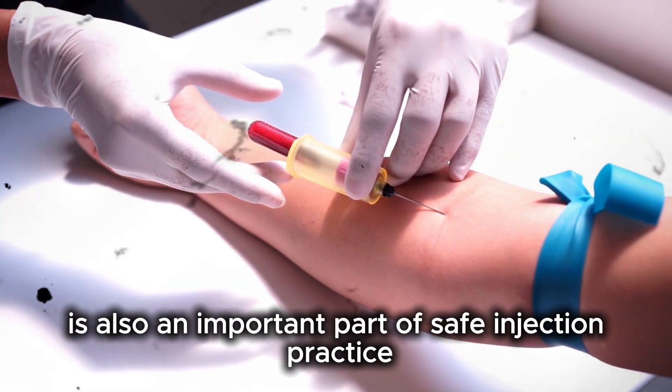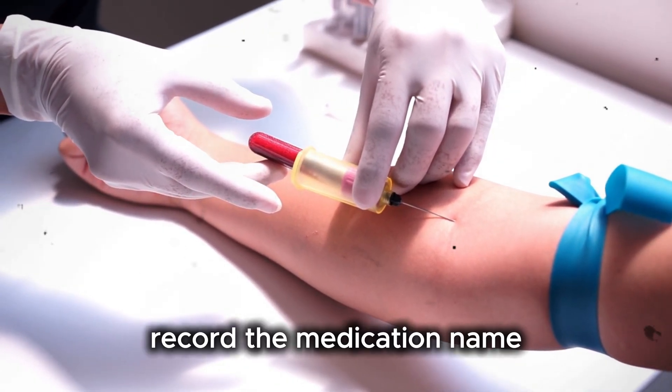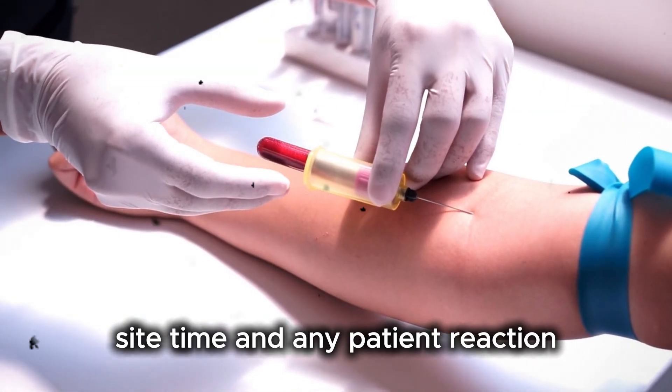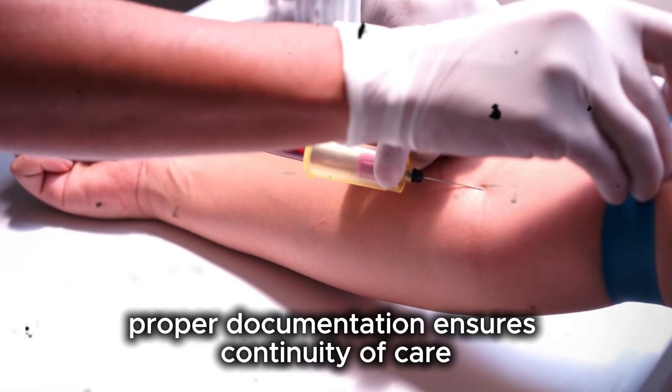Documentation is also an important part of safe injection practice. Record the medication name, dose, route, site, time, and any patient reaction. Proper documentation ensures continuity of care.